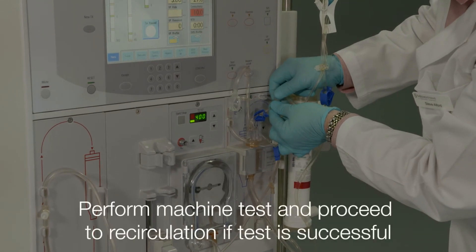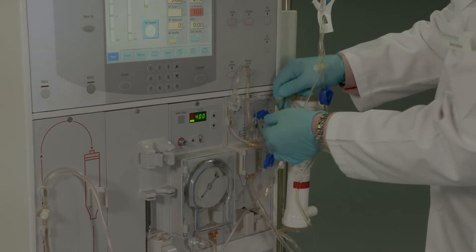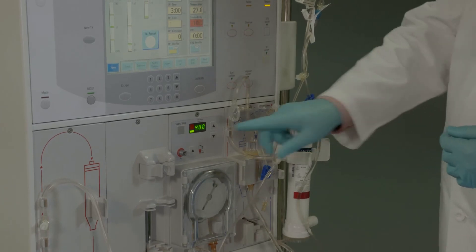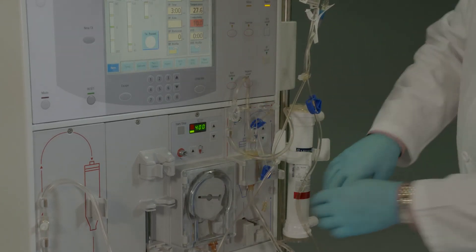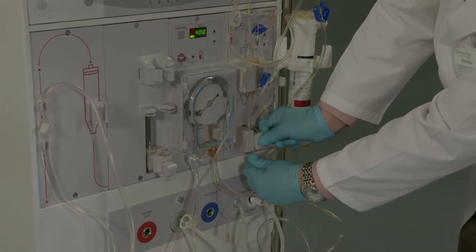The Streamline Express is now ready for recirculation, machine testing, and final setup procedure before initiating dialysis. Perform the machine test per the machine operator manual instructions and proceed to recirculation when the test is successful.